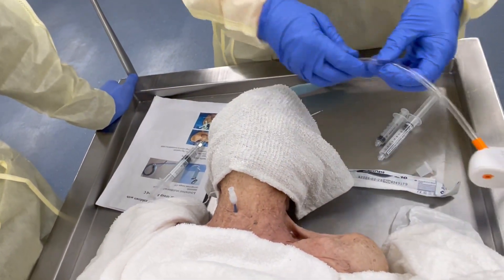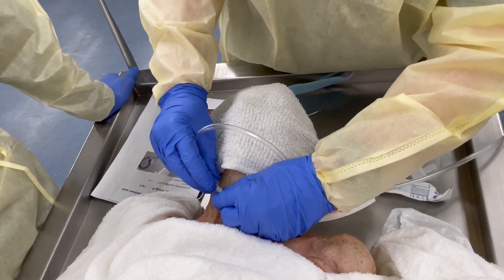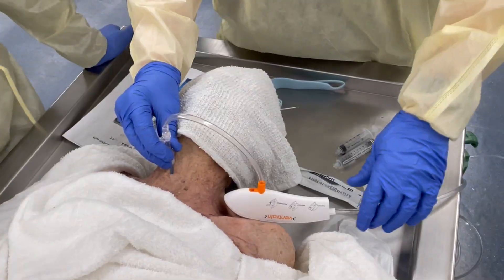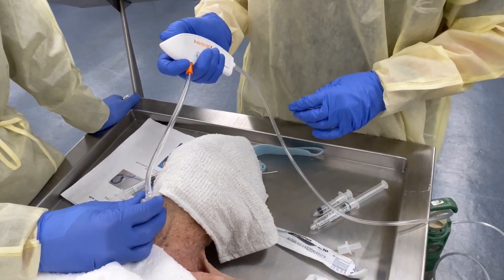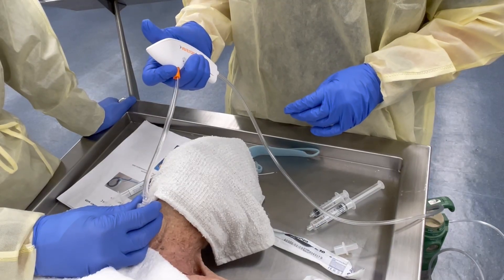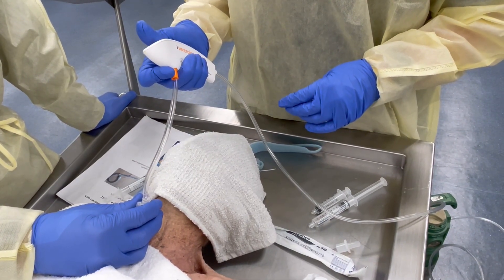Now, let's watch this. We will hook this up. If you stabilize that — two seconds. I'm sucking the air out. Two seconds in — 500 ml. That's at 15 liters per minute.